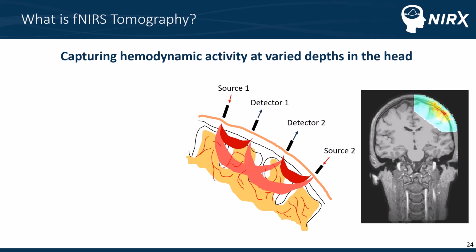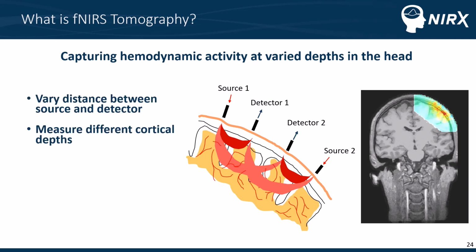What is tomography? Well, that's when you intentionally form channels at varied depths by spacing your sources and detectors at varied distances from each other. It can measure different cortical depths, and it requires complex 3D image reconstruction.